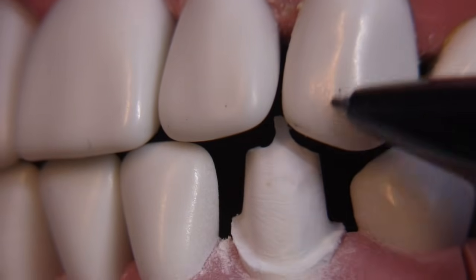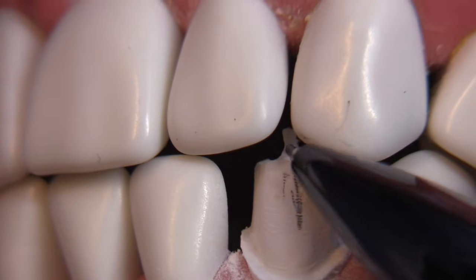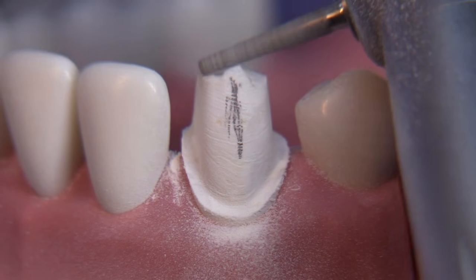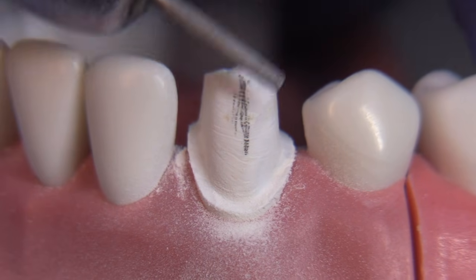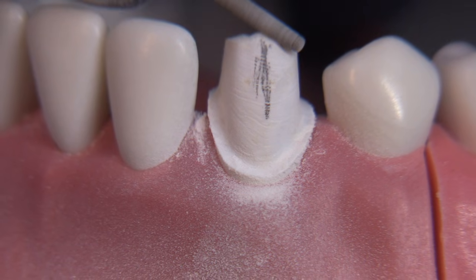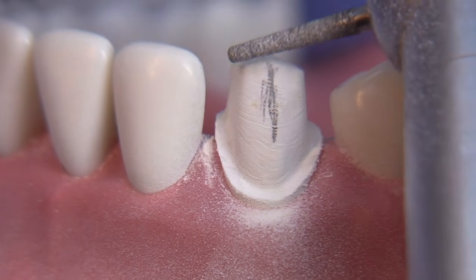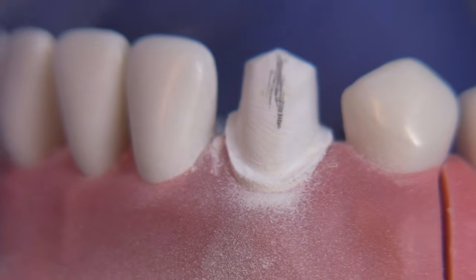It's always good to close the typodont together and check how we're doing on the reduction. We'd like to have the tip of this canine right between the lateral and the canine above. It's nice to finesse that location — if you're taking an exam and you accomplish this, your graders will be very happy. With the incisal part just about finished, let's turn our attention to the lingual.